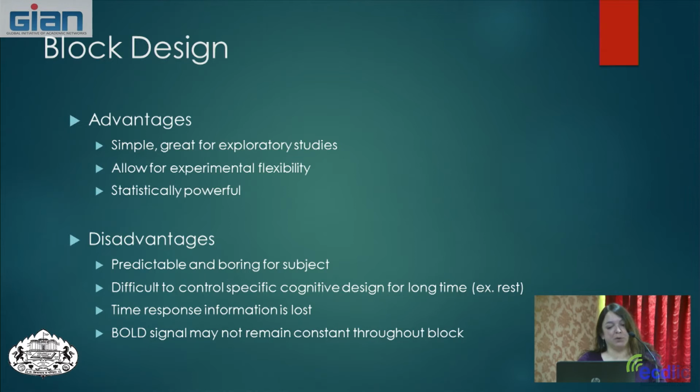Disadvantages might be that they're predictable and sometimes boring for a person. It may be difficult to sustain or control a cognitive design for a long time. The time response information is lost, okay? Because we're showing this repeatedly over and over again, we're actually not looking at the time event of the BOLD signal coming up and down again.